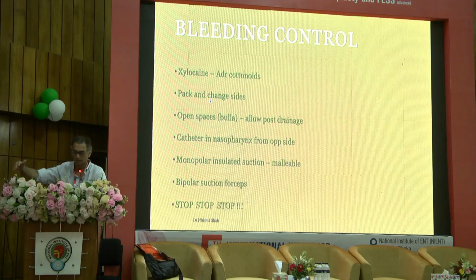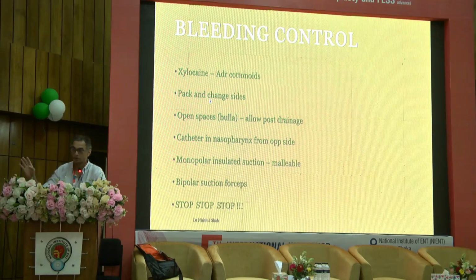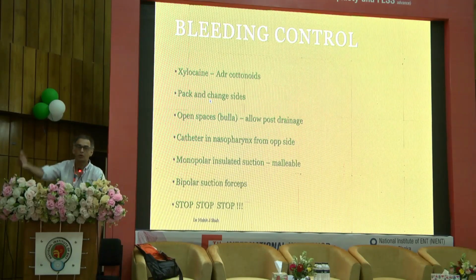And in very rare cases, when there's a lot of blood, you can put a catheter in the nose to drain the blood as you keep operating. In a FESS, this should never come to this stage. But if you're doing an angio, if you're doing a tumor where you can't stop, you have to keep operating because that's your best solution to stop the bleeding, then you can do that.